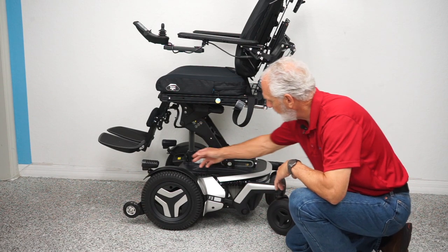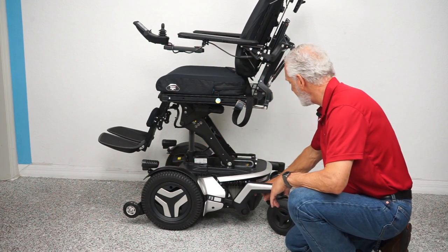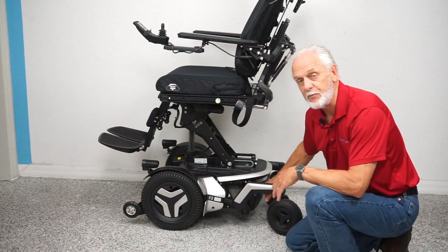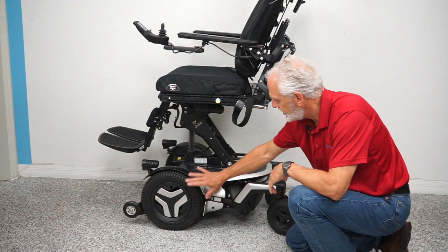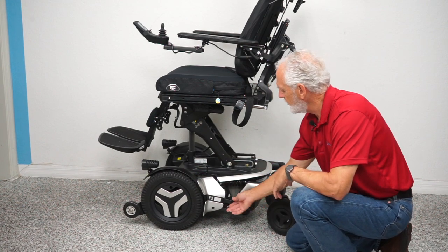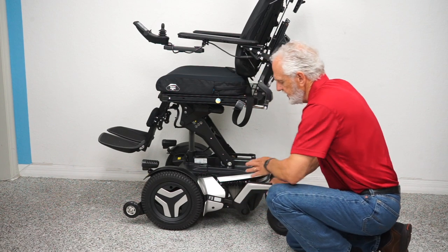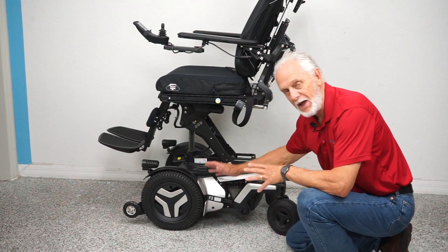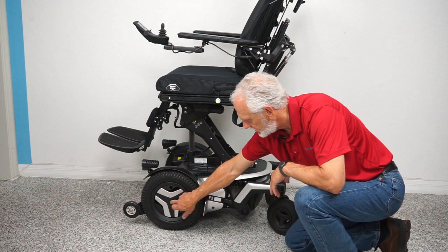There are anchor points inside the fender and in the back — four of them total. This is where you secure your chair if you need to transport and tie it down. There's a motor for each wheel. You can't see the motor, but you can see the handle on the end of the motor. These motors are directly connected to the wheel — no chain, no belt, no mess, no noise.